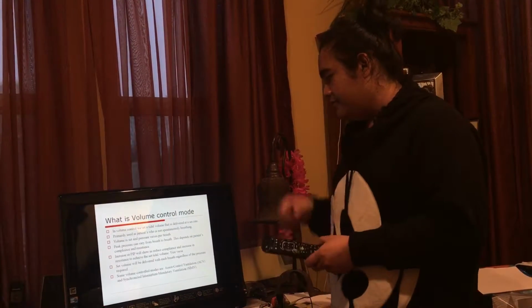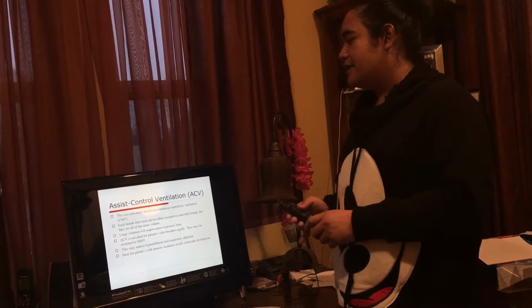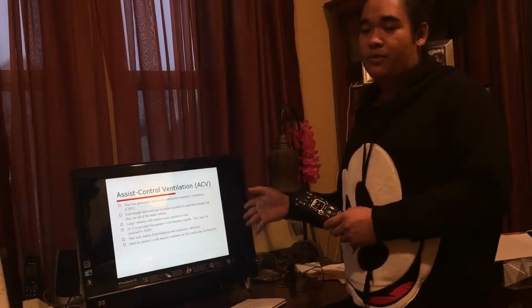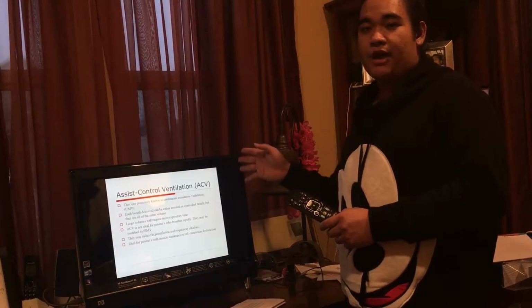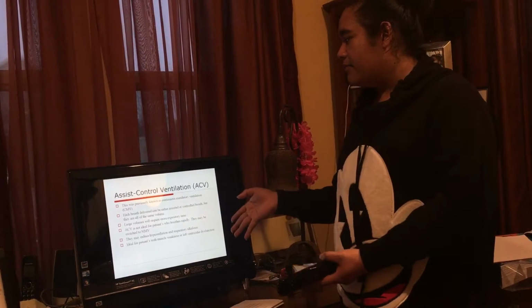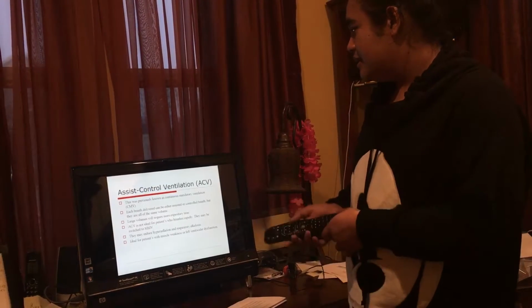So that's good for that. Let's go over assist control ventilation. Again, this is a mode that is volume based.